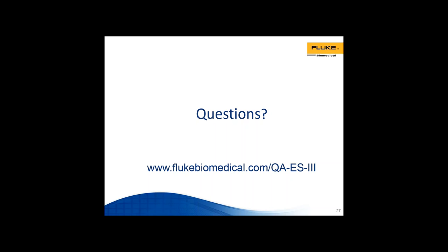Yes, absolutely. I'm sure Jerry would like to chime in here as well because we feel passionately about this one. So yes, the PM maintenance schedule cannot be changed, and the procedure has a given number of steps. But what you can do is condense the amount of time it takes to perform that by automating the device. As many of our end users might already know, when you're manually pushing buttons and driving the analyzer, it's going to take longer versus when you have it connected to a PC and it's automatically making those connections and driving the analyzer in an automated fashion.